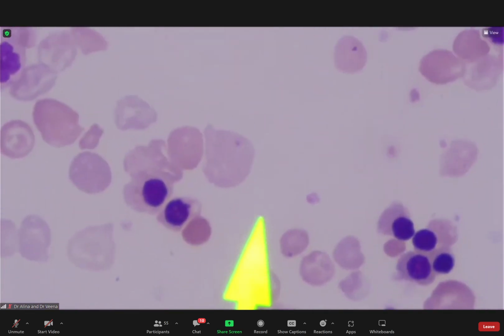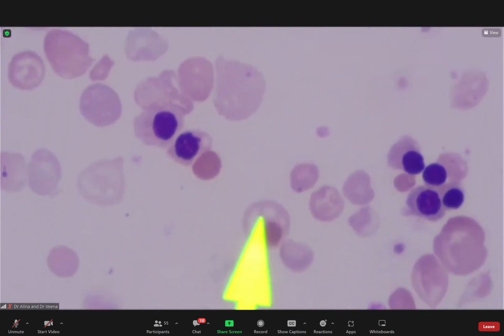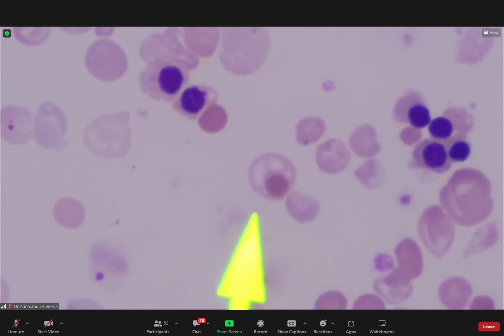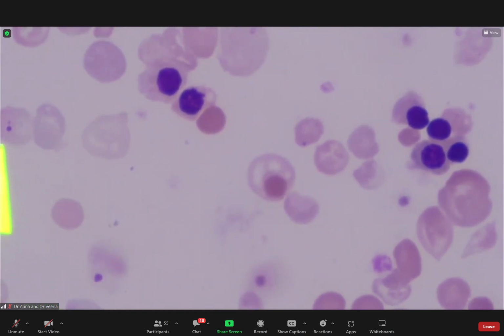And here you have red cell puddling, where the hemoglobin sort of puddles to one side of the red cells. So this was a case of a beta thalassemia major patient with post-splenectomy changes and also some degree of acute hemolysis. Likely hyperhemolysis. But definitely acute hemolysis in the background. Howell-Jolly is more. See the Howell-Jolly body here?